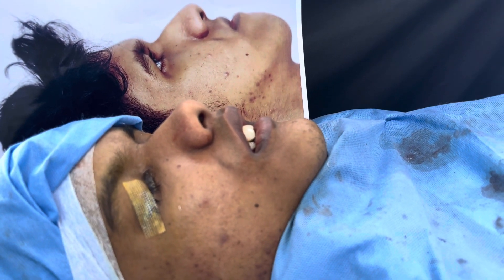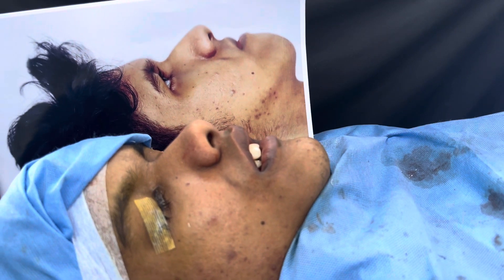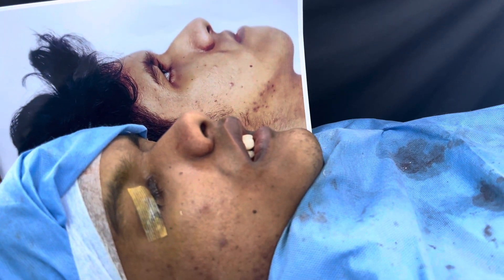We've given him anesthesia via the submental route, so the entire face is open for us to work.